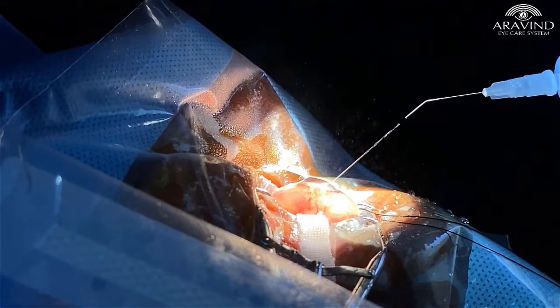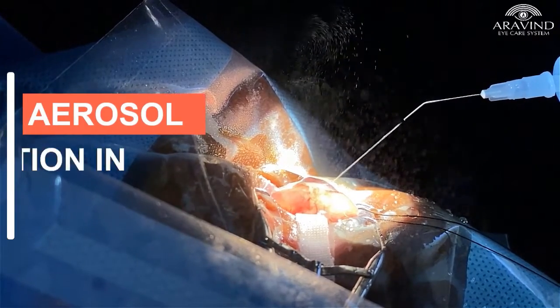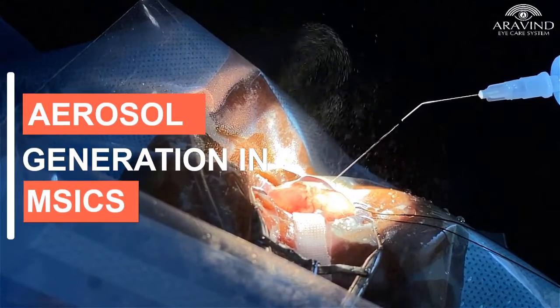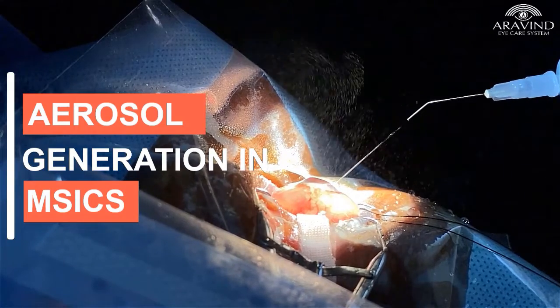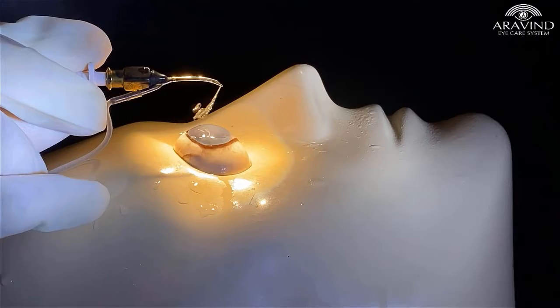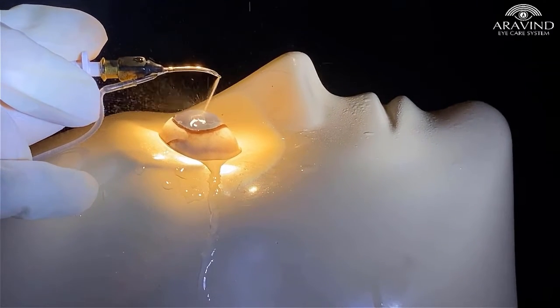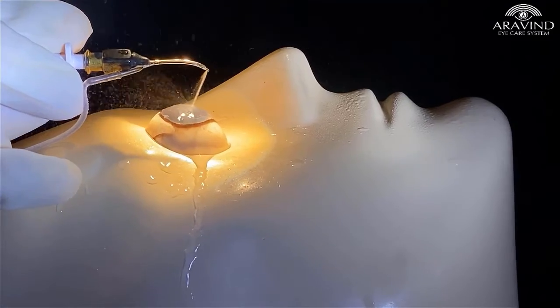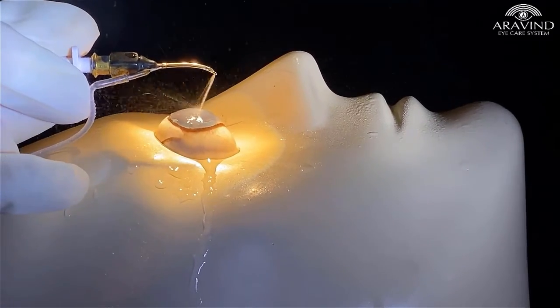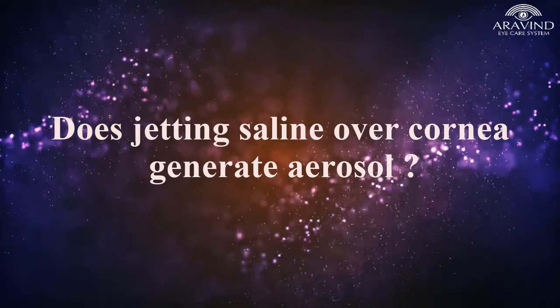So, here we present a video of the steps of manual small incision cataract surgery which have the potential of aerosol generation and a few tips to reduce the same. Some of the experiments demonstrated in this video are done in our wet lab with slow motion video imaging technique to capture the aerosol. Does jetting saline over the cornea generate aerosol?